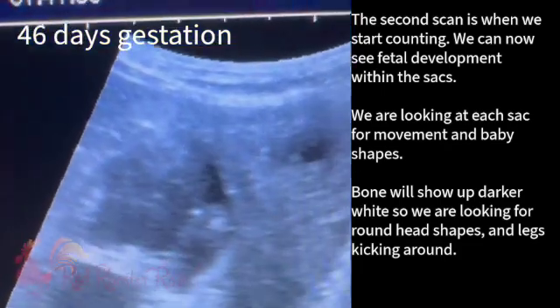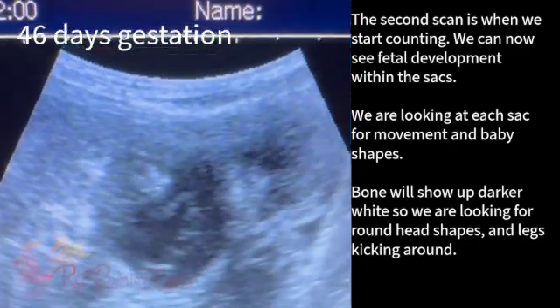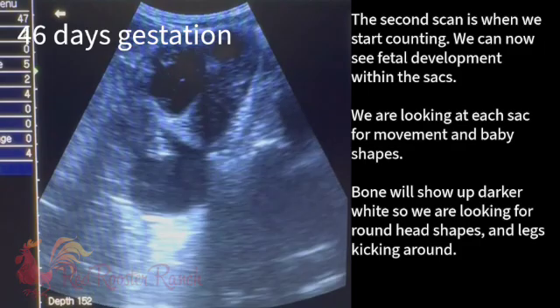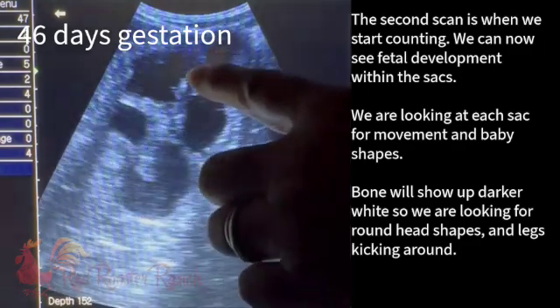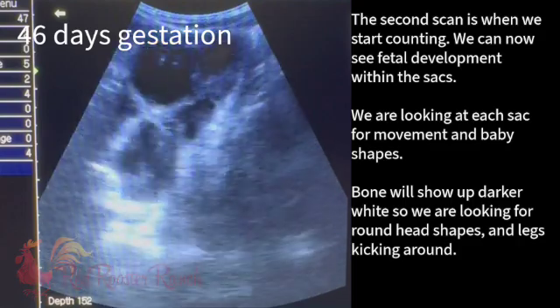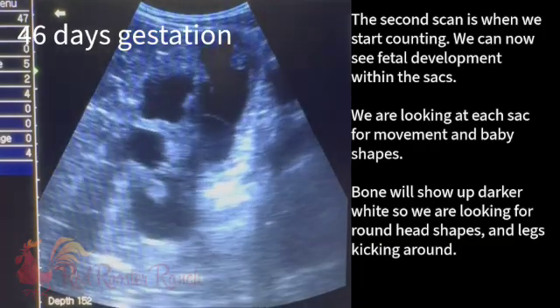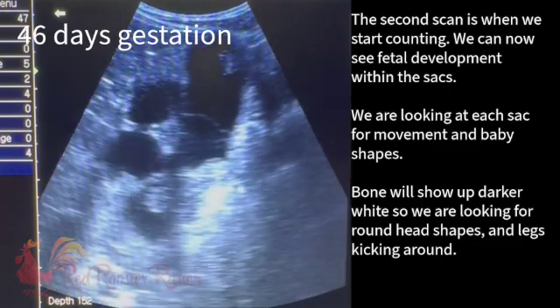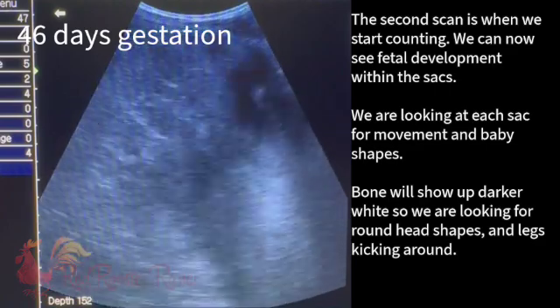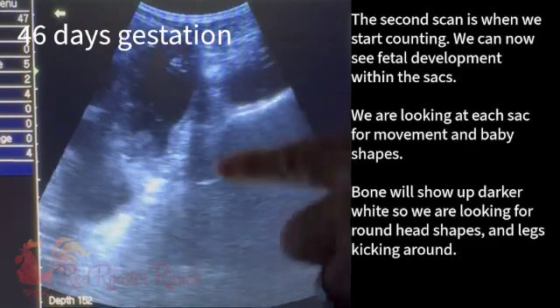I don't know if it's really catching it on my camera. So sweet — a little swimmer. I can't get them all at the same time, but I'm going to do it with very close depth. One, two, three — let's do the bottom one too. I can get those two at the same time. Making sure there's nothing over here that I'm overlooking.